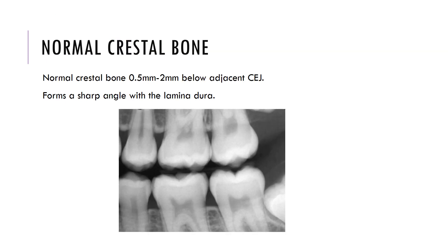The normal crestal bone is about 0.5 to 2mm below the adjacent CEJ and forms a sharp angle with the lamina dura, as can be seen in the image shown here of a healthy periodontium on radiograph.